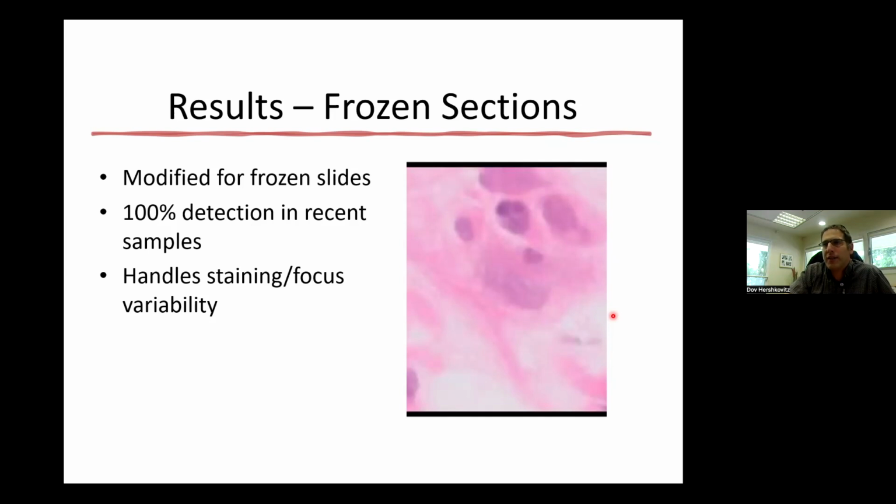The algorithm failed in these samples, but actually the practical use of the algorithm for Hirschsprung would be a patient that is now in surgery and not for 8-year-old samples. So we are very pleased with the ability of the algorithm to highlight the relevant areas.